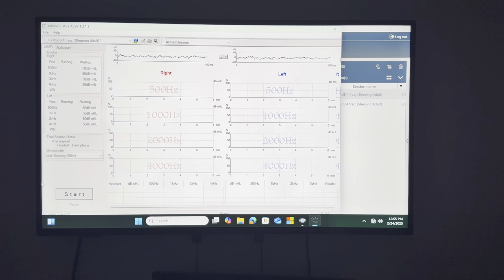So it's a steady state response. Some aspect of the stimulus has to be steady, the rate, so that the response for that steady component is looked at. Is it the rate? Yeah, the repetition rate. So that's kept constant for that particular frequency. The response is looked at at that repetition rate and its integral multiples. So in the Eclipse system, it looks up to 12 harmonics. It performs both amplitude as well as phase analysis.